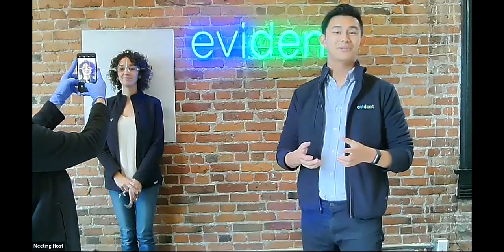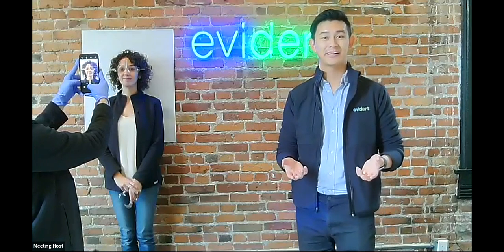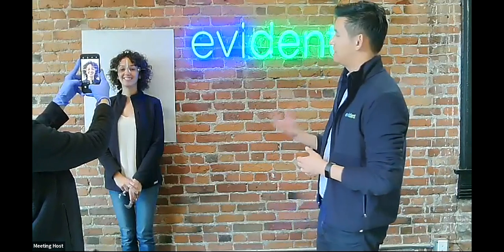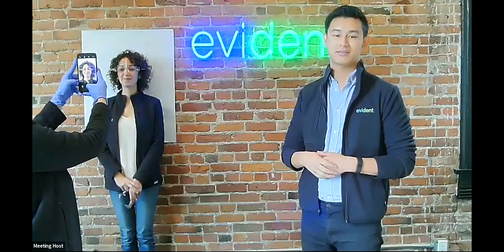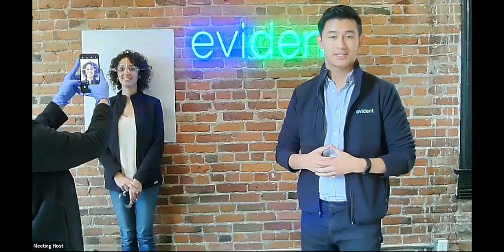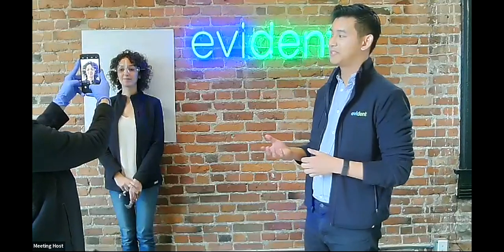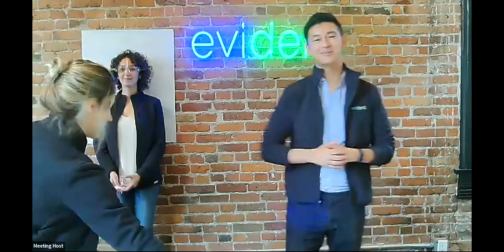Great, and the last photo you need for the dentofacial is the Duchenne, otherwise known as the exaggerated smile. So get the patient to laugh or smile as hard as they can. And what's important here is that we see the top teeth as well as the bottom teeth. So if you're also ordering the smile mock-up, an extra photo that we suggest taking is just a regular smile. And that's it. Taking photos is as easy as brushing your teeth.